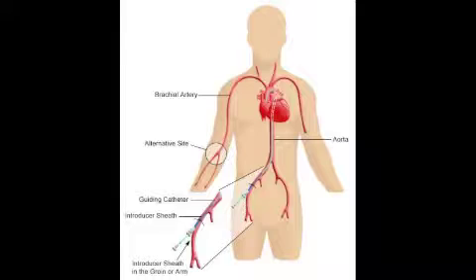The idea behind the procedure is to go in and put a stent in, which is represented by the black area on this artery. The yellow still being plaque pushed against the side of the walls and now restoring blood flow throughout the heart. During this presentation, I'll be discussing the different access points, radial, femoral, and brachial, as well as the stents of drug-eluting and bare metal stents.